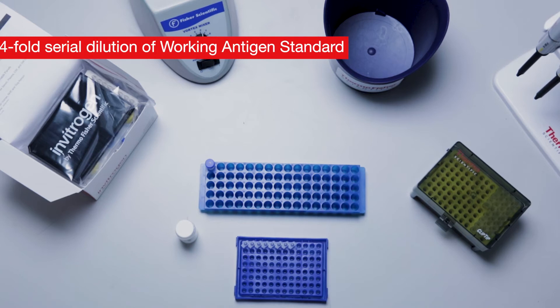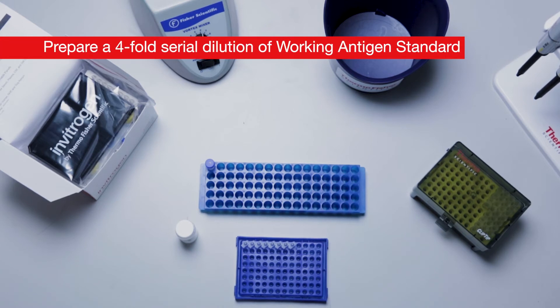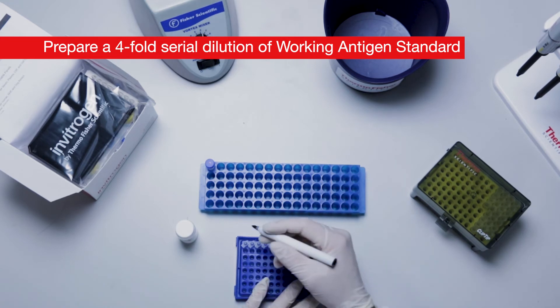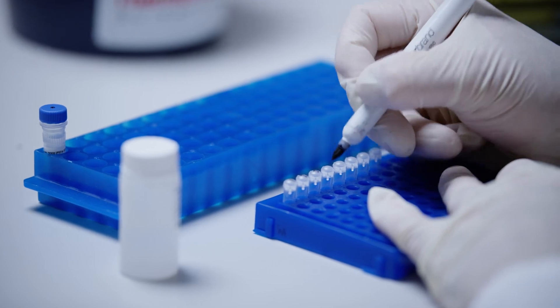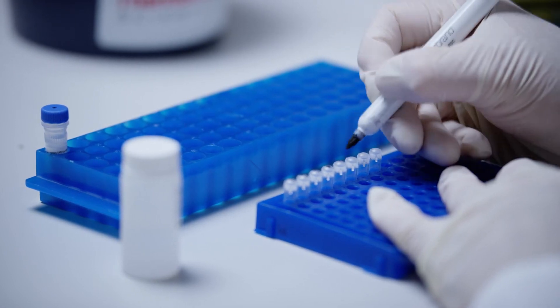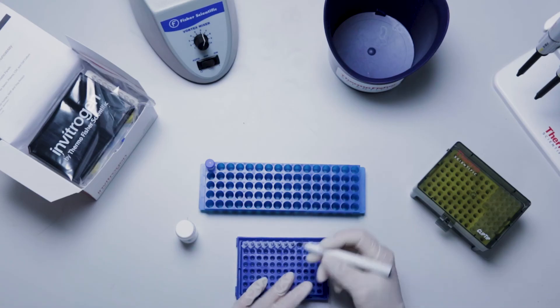Prepare a four-fold serial dilution of the working antigen standard vial using the eight-tube strip provided. Label tubes sequentially standard 1 through standard 7. Label the eighth tube for use as a background.